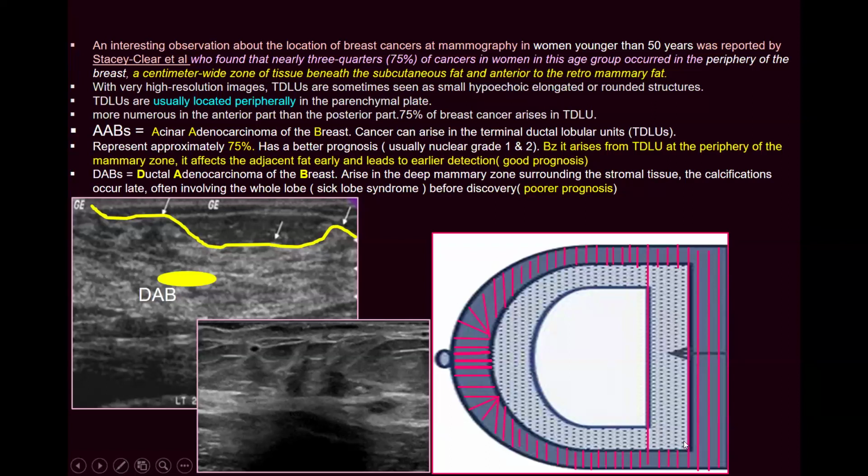Okay, this illustration is the breast, the whole breast. And this is the pre-mammary zone, the retromammary zone, and this is the mammary zone. This is all the mammary zone. Looking at the mammary zone, this is 1 centimeter from the contour of the fat glandular interface, posteriorly, laterally, and anteriorly, like that. This one is 1 centimeter.